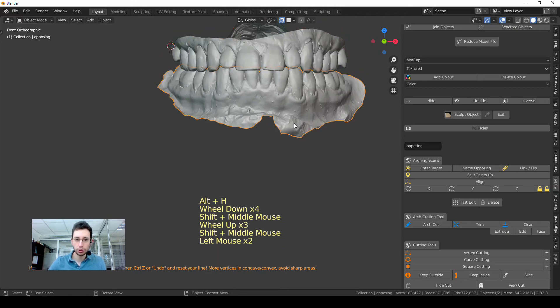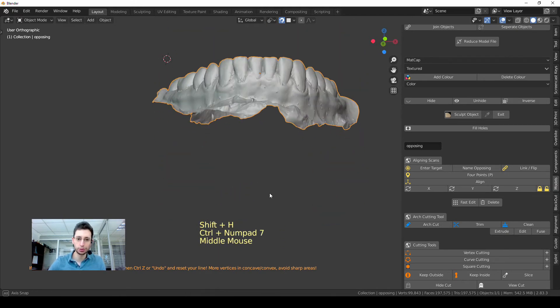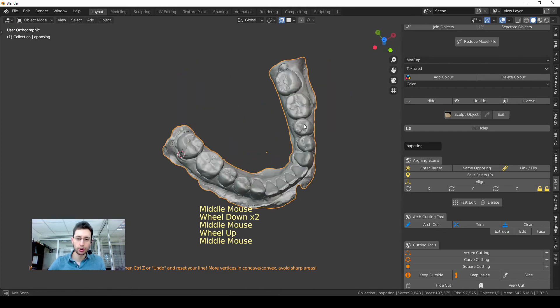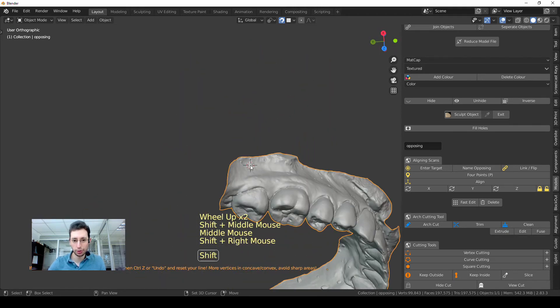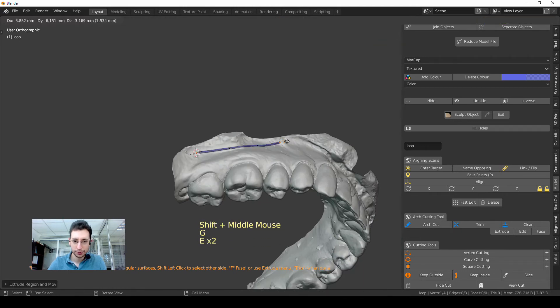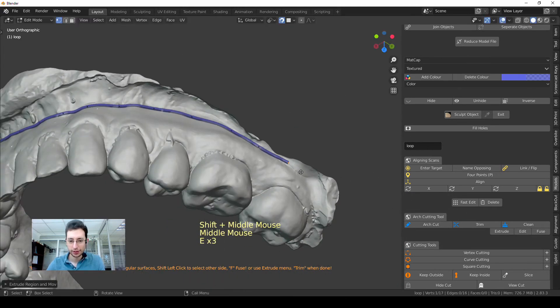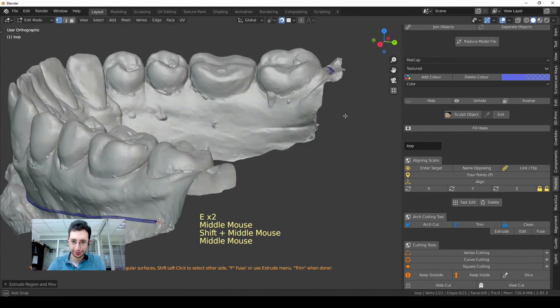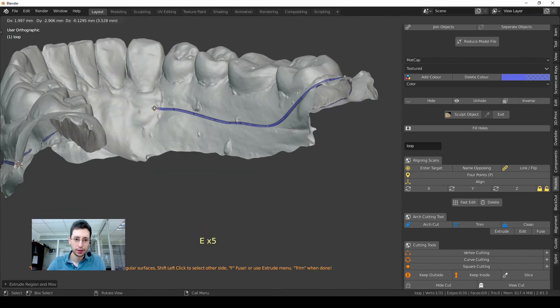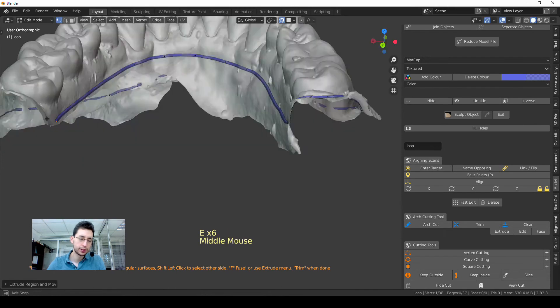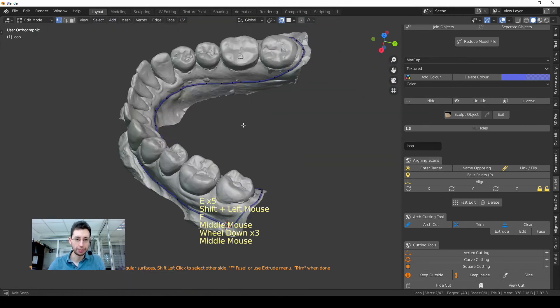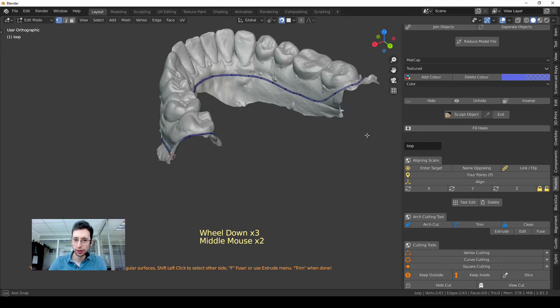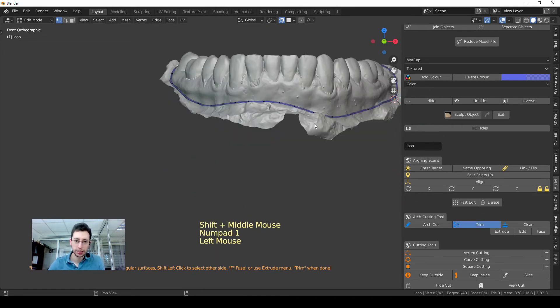The same thing for the lower model. I will do it a little bit faster in order to make this video shorter. Okay, it's done. Once I'm happy with my selection, I press Trim and then Clean for removing all the unnecessary parts.